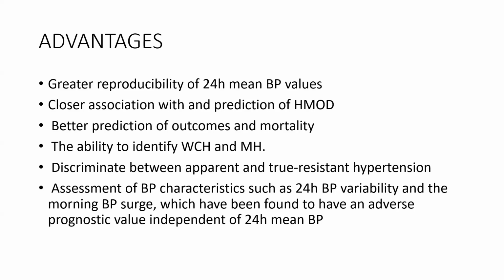It's also able to assess BP characteristics such as 24-hour BP variation. Some people may have an early morning surge, and it's also noted that this early morning surge independently has adverse prognostic value.